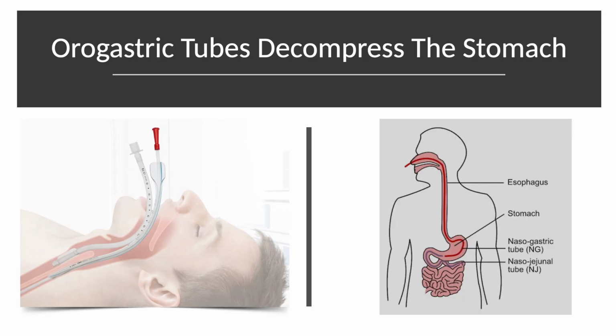When you're using any kind of airway device, whether it's a bag or a supraglottic, if this is an unconscious patient without a gag, there's always a danger of overinflating the stomach with air, and that's going to do a couple of things. It's going to take up a lot of the volume in the chest where you would like air exchange to occur. It's going to be displaced by a distended stomach. And not only that, but a distended stomach, if it decompresses for some reason, you can end up with a lot of vomit in your airway, which nobody likes.